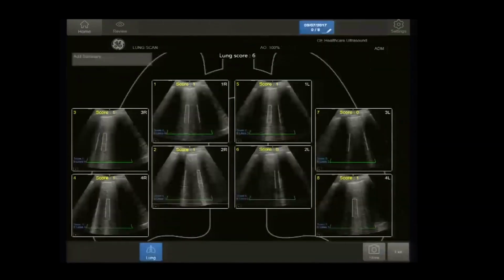And then into the review screen, and here you can see the full review screen that's completely filled. You can take more than one image in a zone. I only have one image as an example right here, but you can add a summary. You can review multiple images, delete some of them if you wish. So it's a very, very helpful and important view that we have.